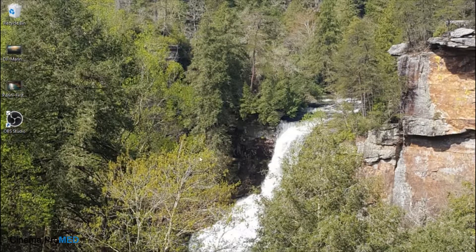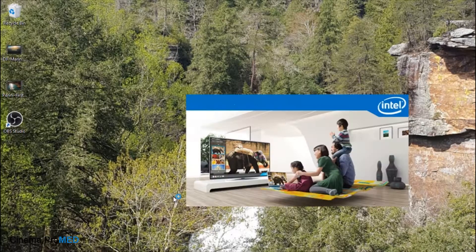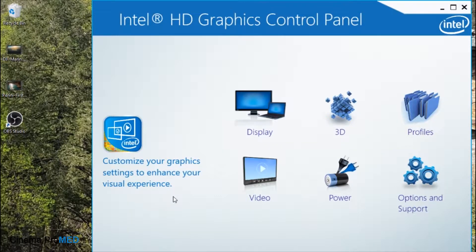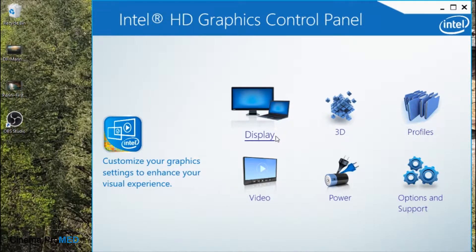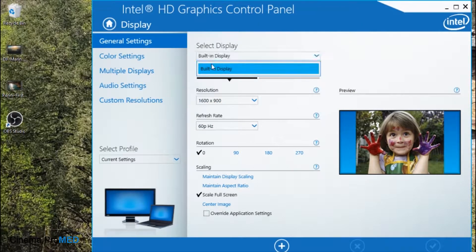First, go to your desktop on your PC, right-click on the desktop, and scroll down to Graphic Properties. On this particular machine there's an Intel graphics card, so it pops up the Intel dialog. If you have a different graphics card — say an Nvidia or another brand — clicking Graphic Properties will still open up a similar dialog panel. We're going to click on Display and open up the properties about our display.